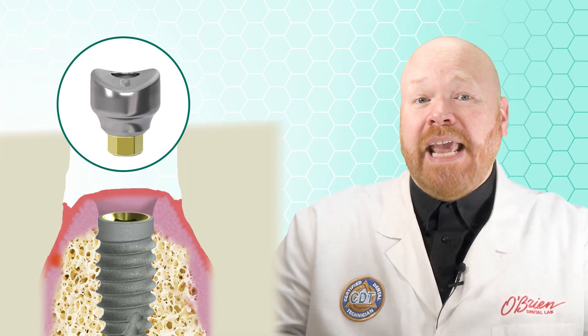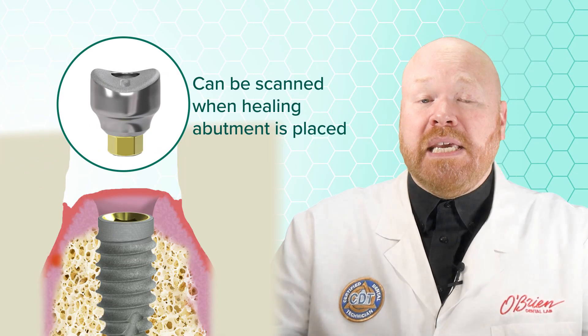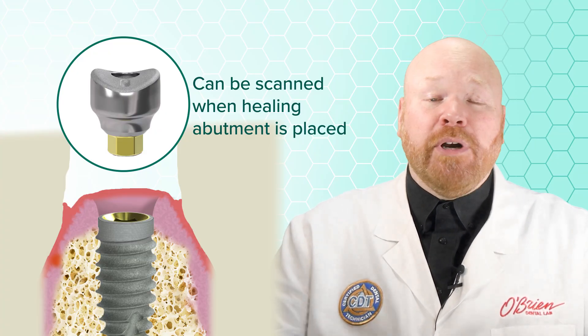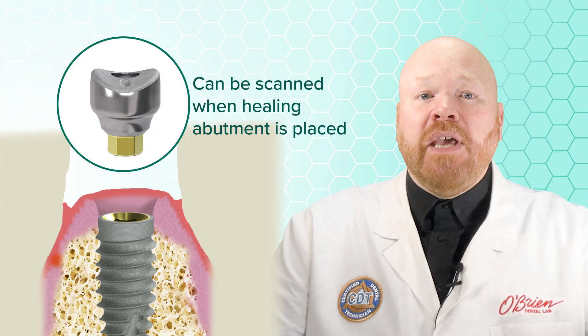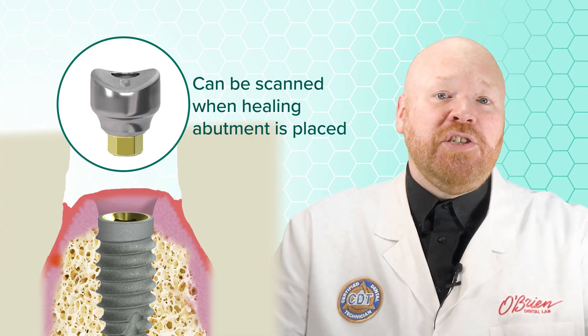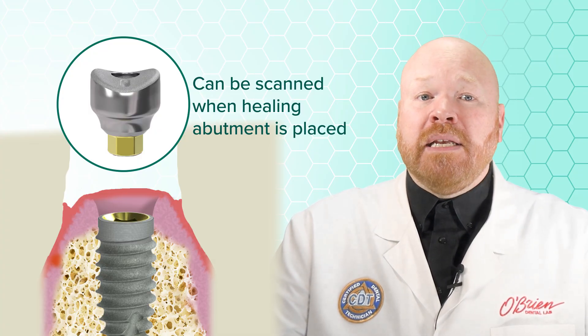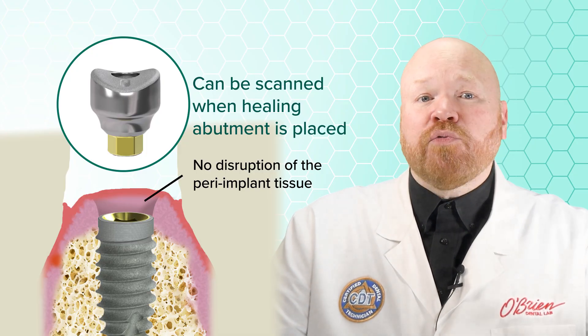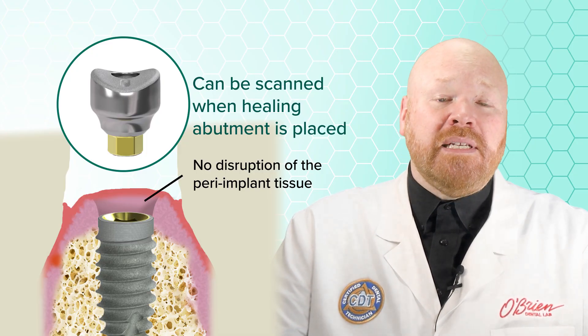In fact, the scan can even be done at the time the healing abutment is initially placed, so that the patient doesn't even have to come in for a separate impression appointment. The other big advantage is that since you aren't removing the healing abutment, there's no disruption of the peri-implant tissue, and that's really beneficial in preserving tissue health.